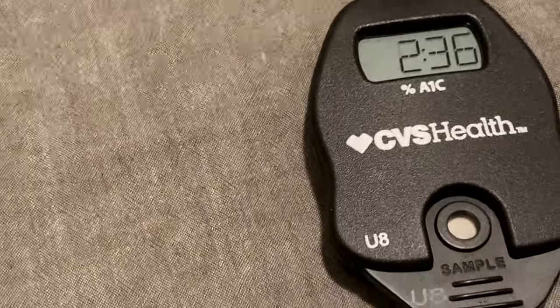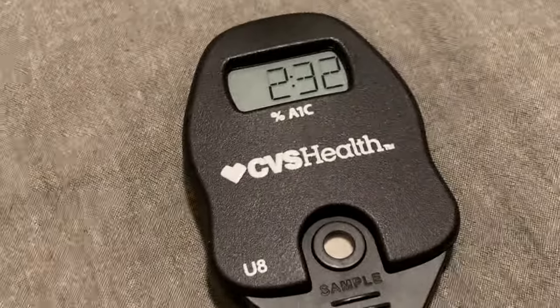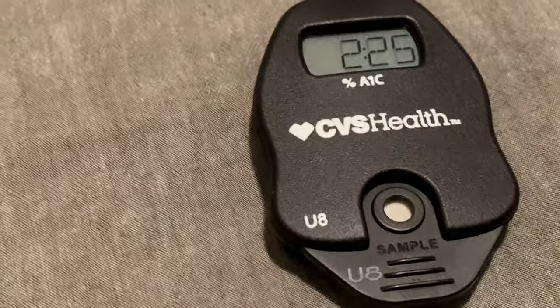Yeah. That's automatic. When you press this thing down, it dispenses it automatically. Meg was concerned that I got the correct amount of blood, but we're sure of that.